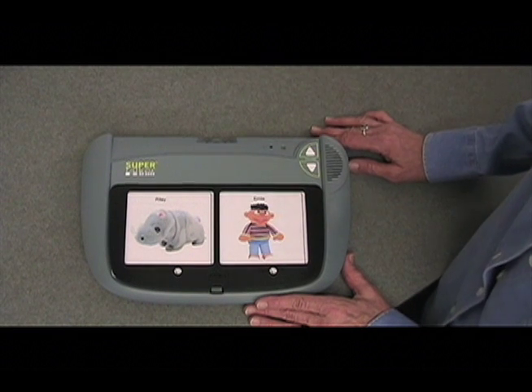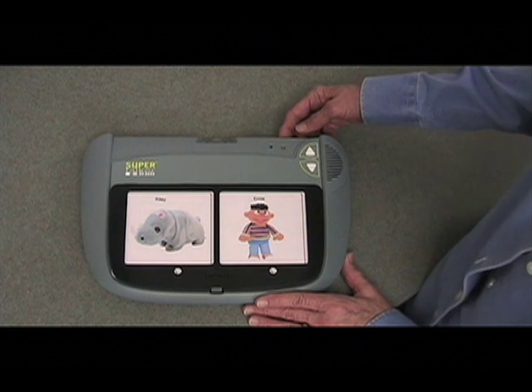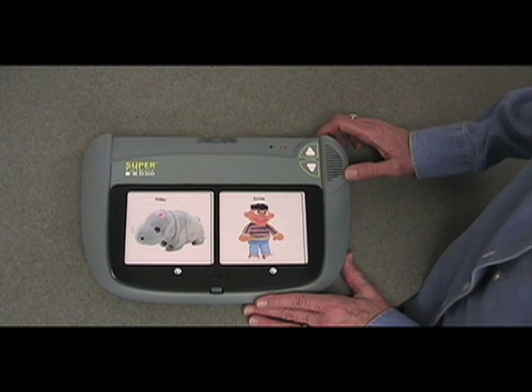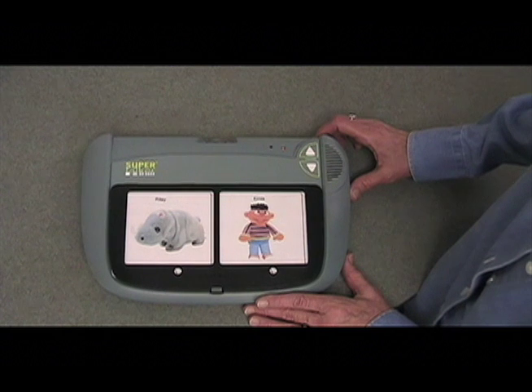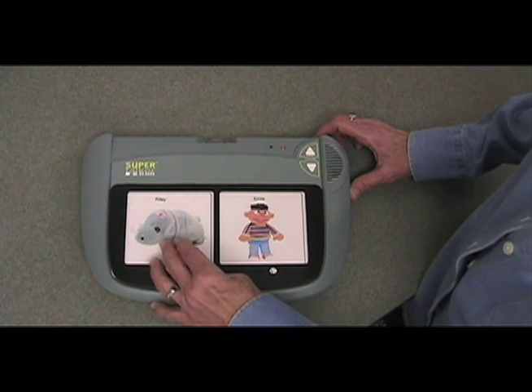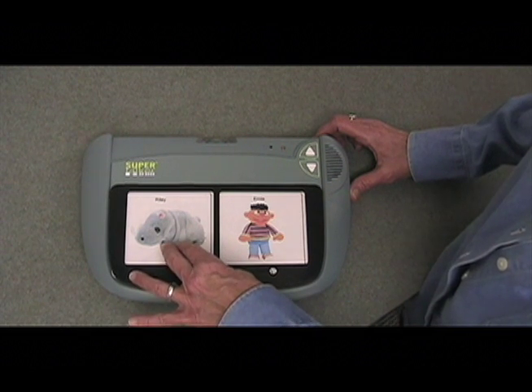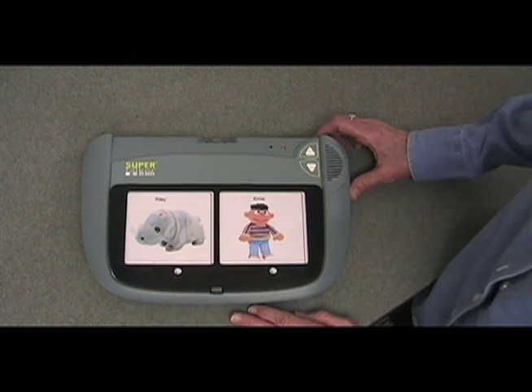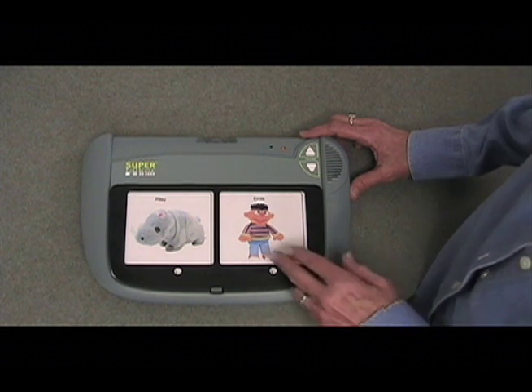And then to record the messages, we push the record button until the light turns red. Then we release it and we're in record mode. Then we push the button and record the message that we want recorded. This is Riley. I can make Riley roar. Roar, Riley! When we're finished, we release that and hear a little beep, and that means that your recording for that message is done. We'll do the same thing for Ernie.